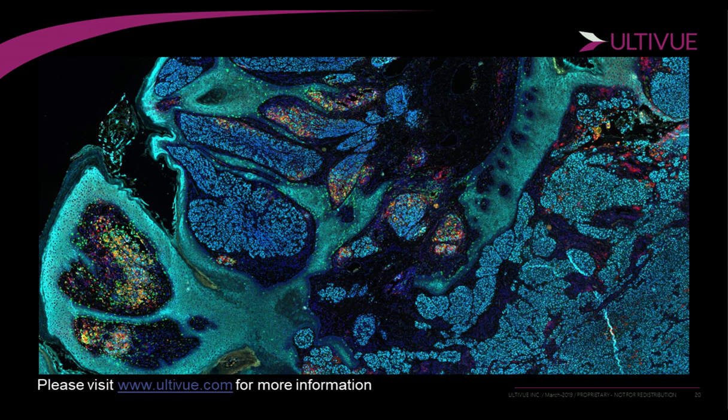So for swapping fluorophores, that's not something we typically do. We pick the fluorophore specifically just to make sure that there's spectral isolation, so you don't have any bleed through or crosstalk. All our Axioscans here that we run are actually Cy7 enabled.